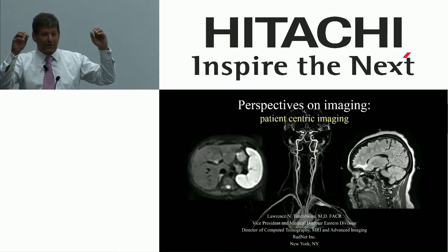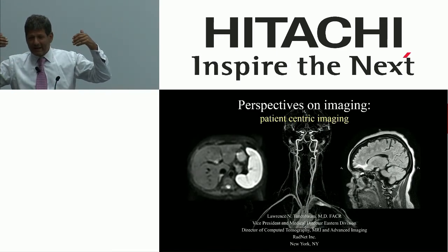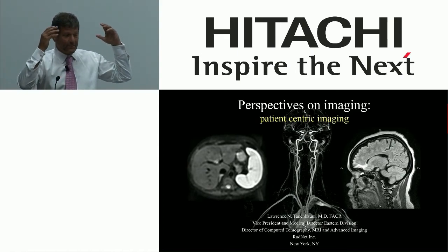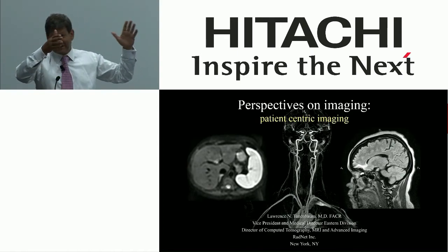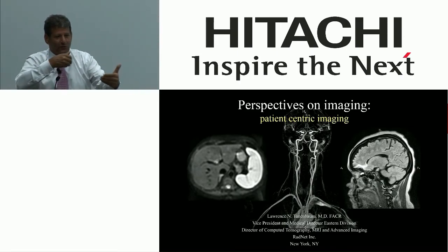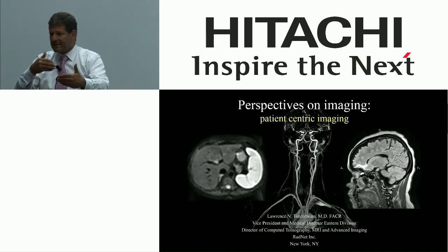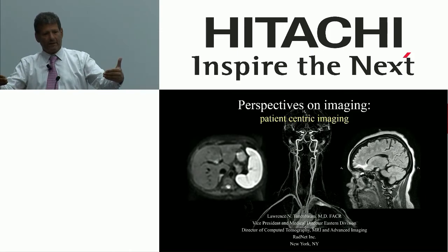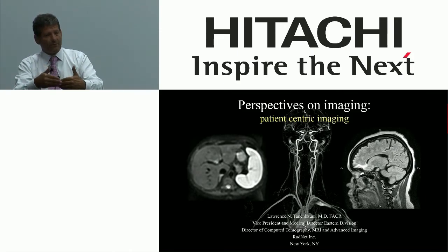that had that look that radiologists like, that grainy, high-resolution look. Radiologists love noise, okay? It's been shown in CT, actually. You can take an image that has no noise, and the radiologist says it's too smooth, and then we throw the noise in, and they say, oh, I love that image. Okay, well, it's all artificial noise we're throwing in. MR radiologists feel the same way. But we pulled that graininess out, and all of a sudden the image has more appeal. You get rid of that background noise and subtle pathology comes out.